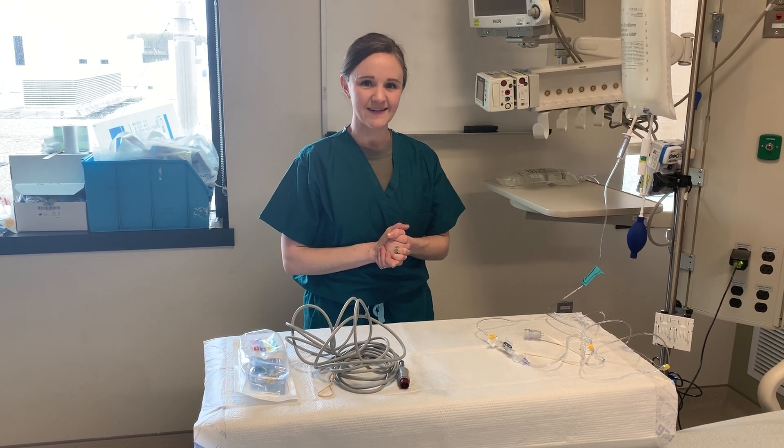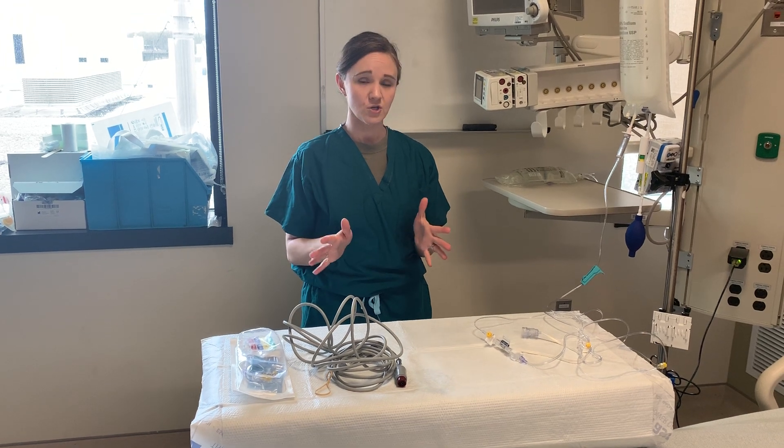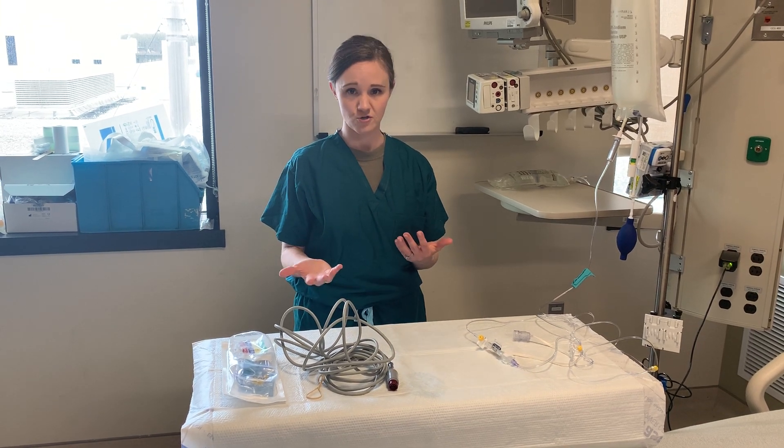Hello everyone, my name is Mavis Bean. I'm a critical care nurse in Bethesda, Maryland, and today I'm going to show you how to set up a basic pressure line that you can use to transduce an arterial waveform or a central venous pressure waveform.